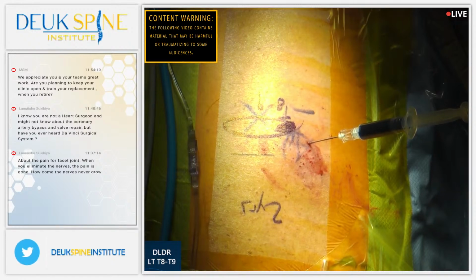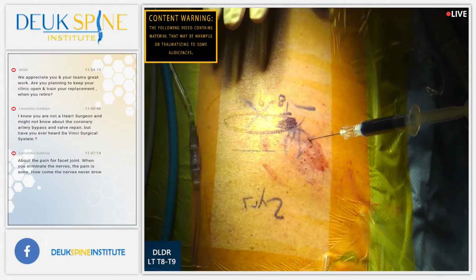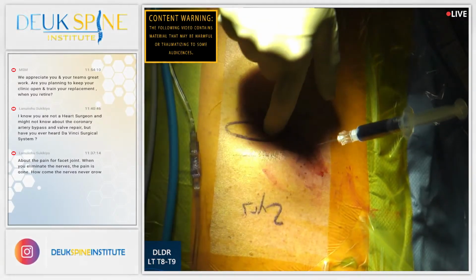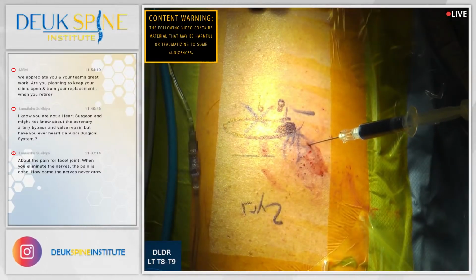Let me know when he's awake. Are you awake? How you doing, my friend? You okay? We'll give him another minute. So, Henry, let's show our audience how herniated discs like T8-9 herniation can cause so much localized pain for patients right in their spine. Copy that.